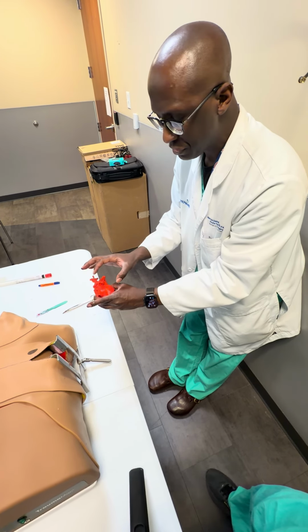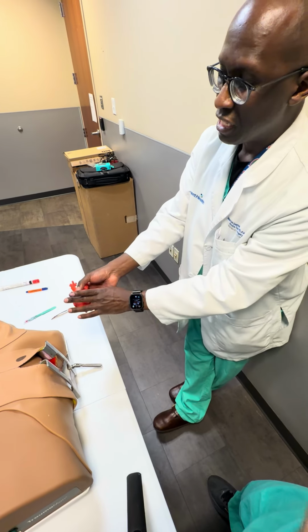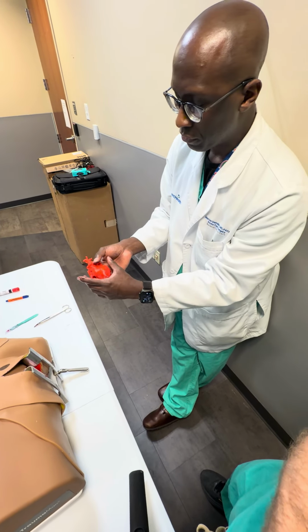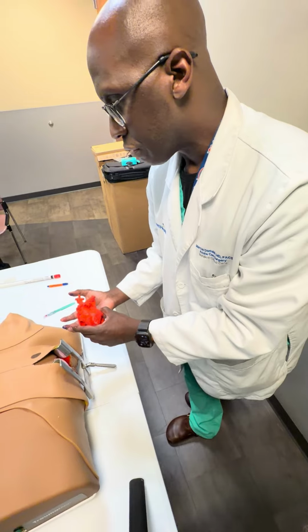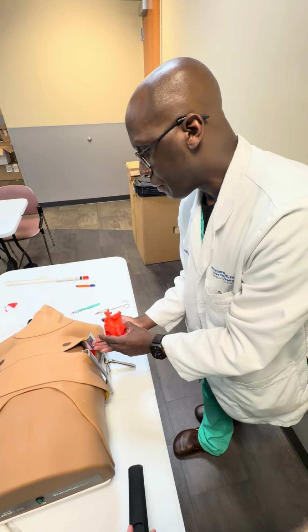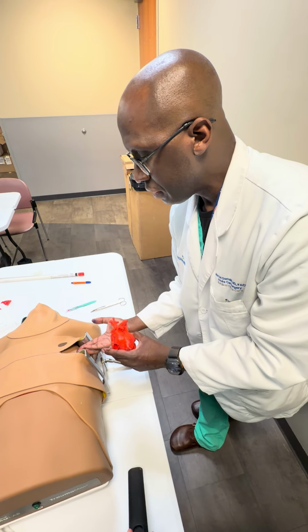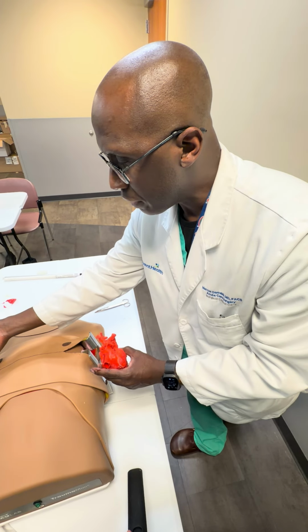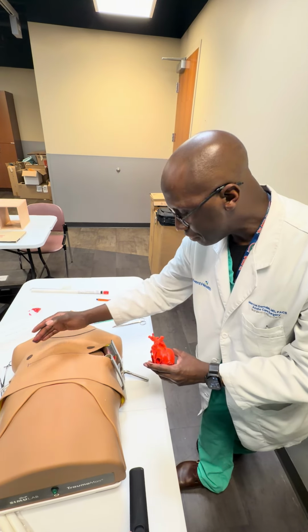And again, even if you don't see anything that looks like tamponade, you still want to deliver the heart out of that sac in case there's clot or something behind that you may not immediately recognize. If I don't have ROSC, or return of activity, at that point, I'm going to take my hand, go anterior, go to the anterior mediastinum and pop over to the right side to decompress that side if I don't have a chest tube already in.